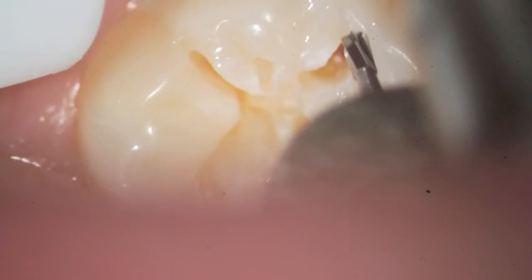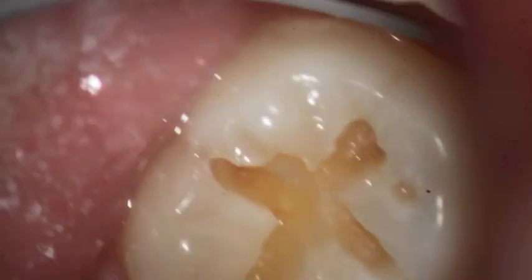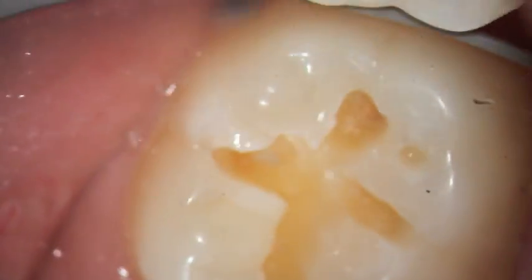And we're using a little bit of larger drill bit to remove some more enamel so that we can see exactly where the decay is. Because if that's left behind, it will go ahead and percolate and develop into an even larger cavity. So you can see the brown area there.